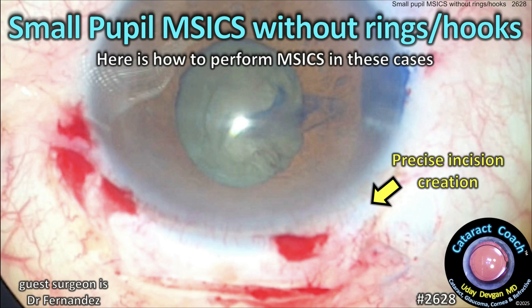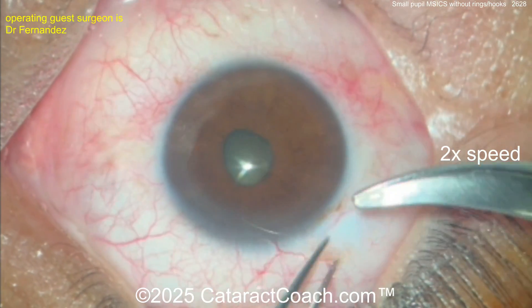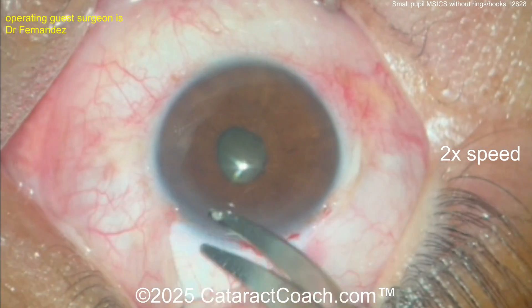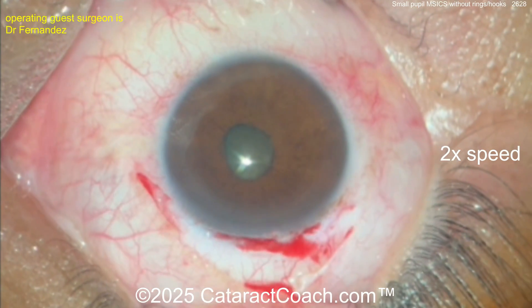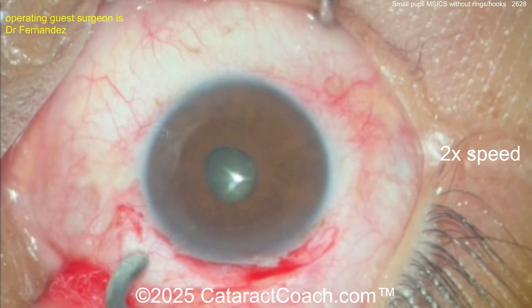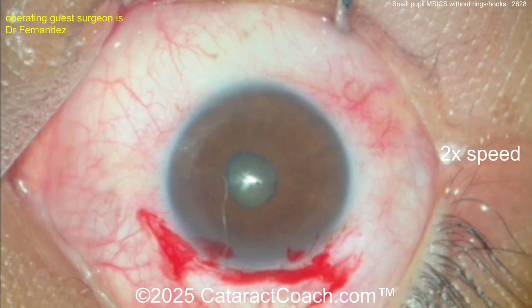Cataractcoach.com — small pupil MSICS without rings or hooks. Here's how to perform this small incision cataract surgery. We're starting off with the peritome; you can see the surgeon is seated superiorly, good positioning of the eye. The speculum is in with nice good exposure. A little bit of cautery here to achieve some hemostasis.